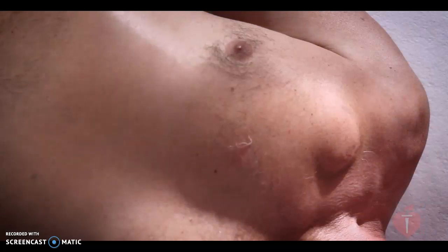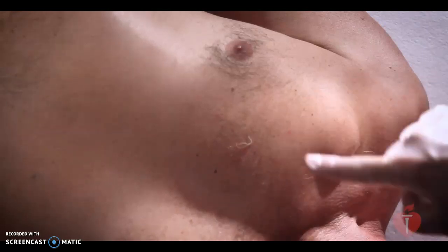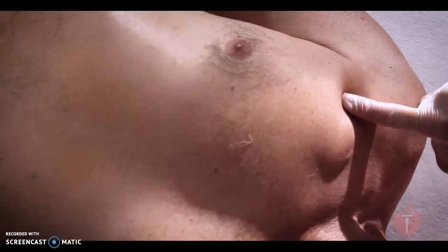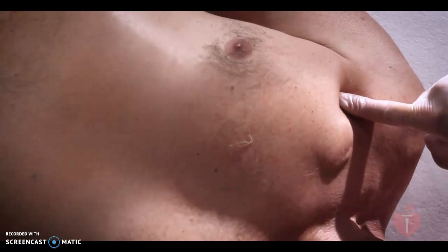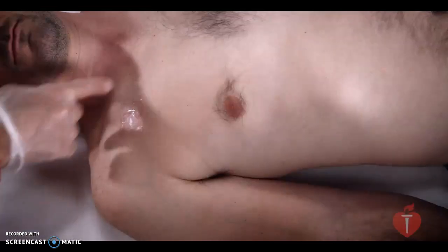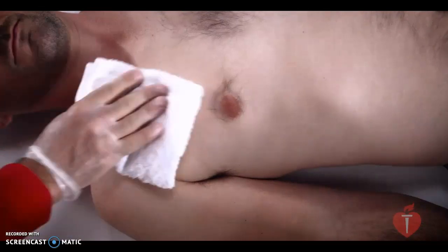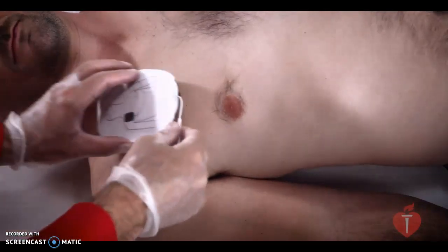Some people have an implanted pacemaker or defibrillator in the same place where you would put the AED pads. These devices look like a round or square lump smaller than a deck of cards. If you see this lump, avoid putting the pads directly over it. Also, do not place the pad directly over a medicine patch. If a medicine patch is located where you need to place a pad, take the patch off and quickly wipe the chest before you put on the pad.